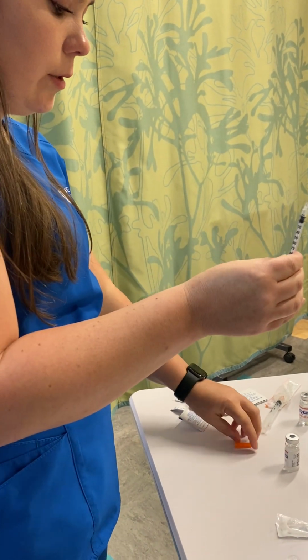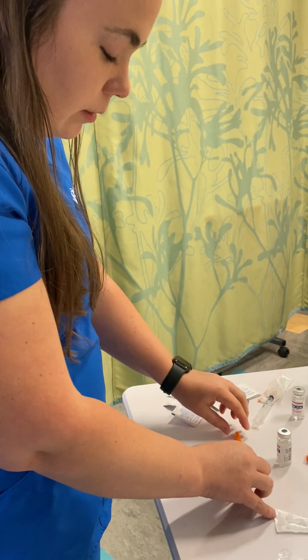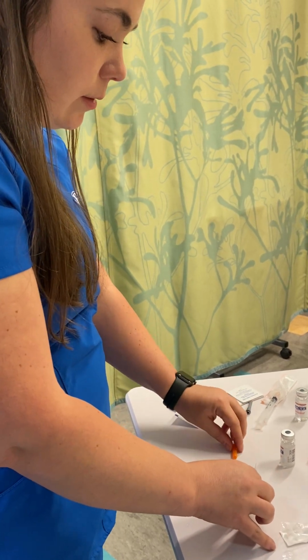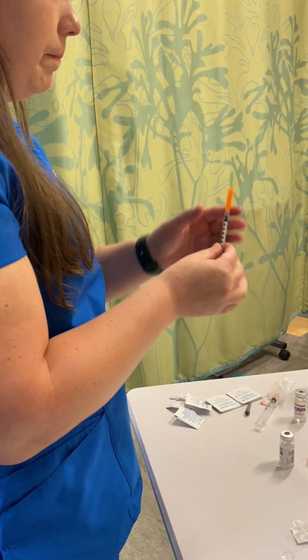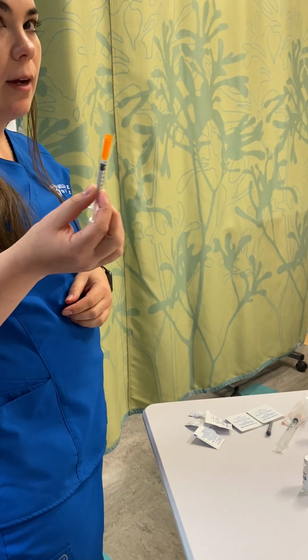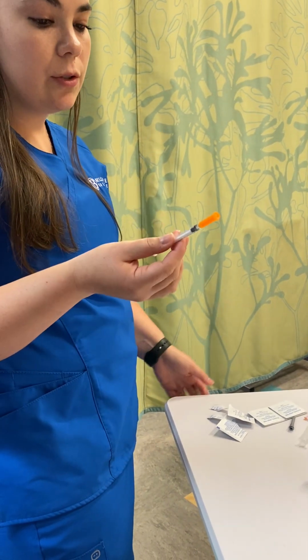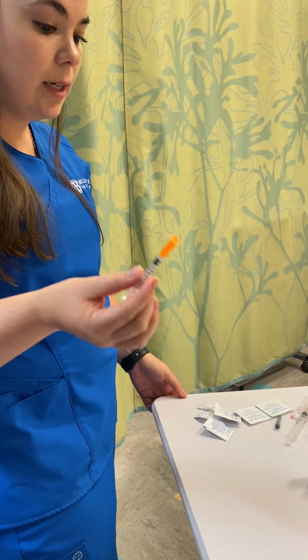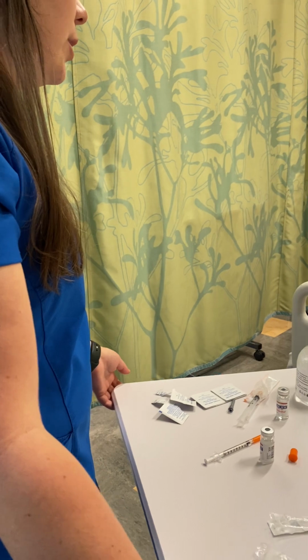And then we would recap using the single hand method. And then make sure to label this one with our concentration, the medication, patient's initials, my initials, the date and the time. Moving into the patient's room.